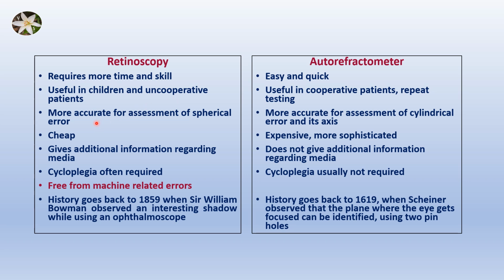It is more accurate for assessment of a spherical error. It is cheap, gives additional information regarding media, and cycloplegia is often required. It has an additional advantage that it is free from machine-related errors.